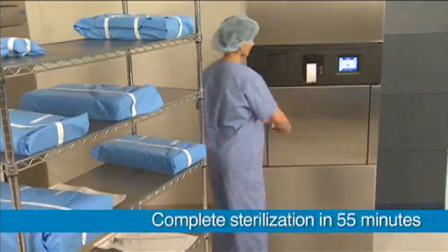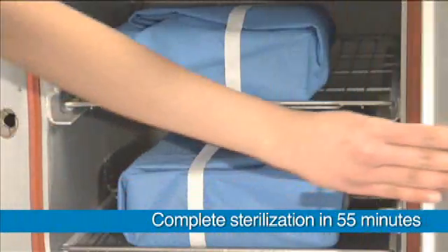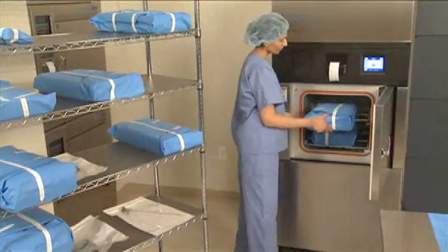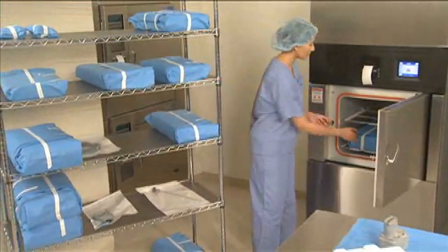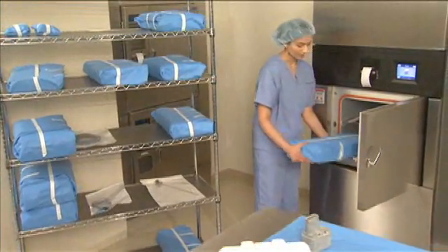The result? Dry, packaged, and sterilized devices that are ready for use in just 55 minutes. And storage capability means no waiting around. Devices are packaged and ready to use for the next procedure.